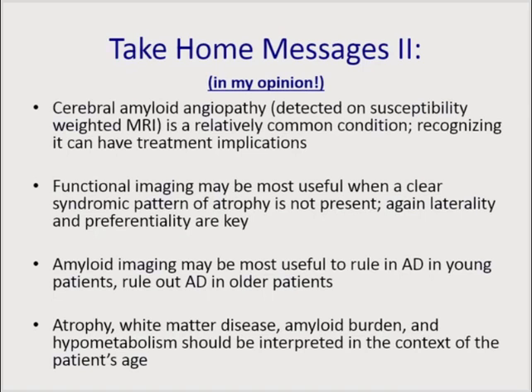And again, all of these imaging measures, atrophy, white matter disease, amyloid burden, and hypometabolism, can be affected by age. So it's just important to take that into account.